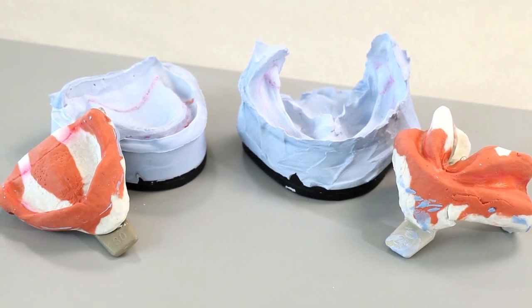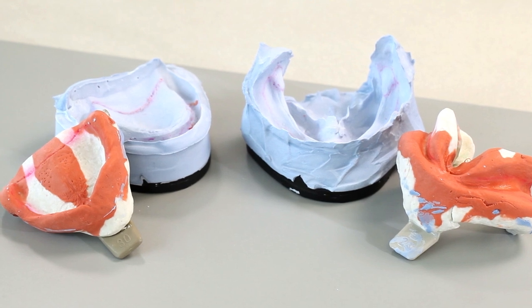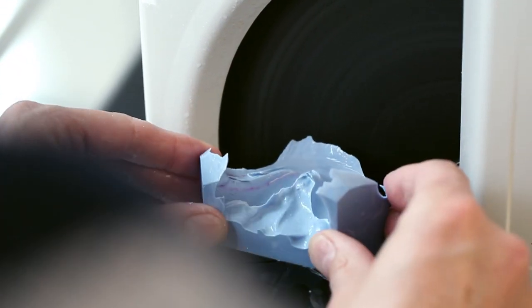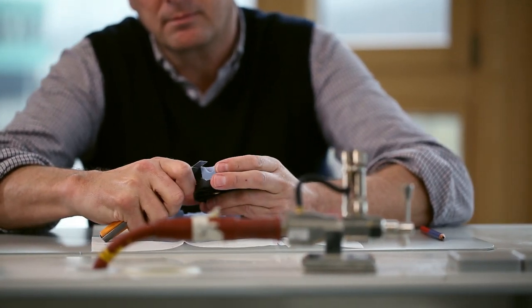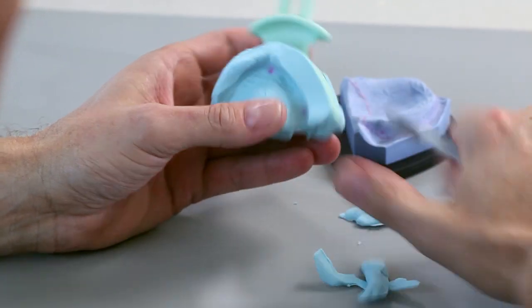Remove any flaws from the impression, such as air bubbles, pressure spots, extraction wounds, flabby ridges, etc., already at this stage. Use a split cast plate. Detach it now. Trim the models and smoothen the sharp edges. Cut back the preliminary impression to ensure stable three-point support of the models.